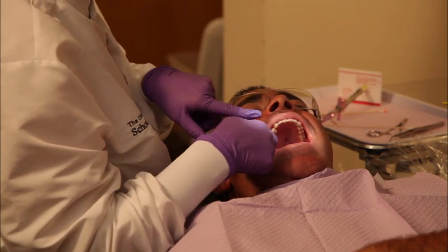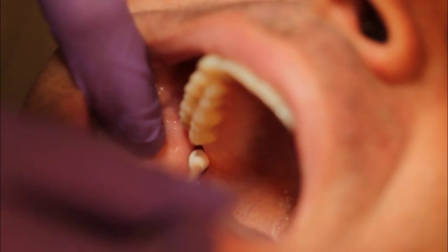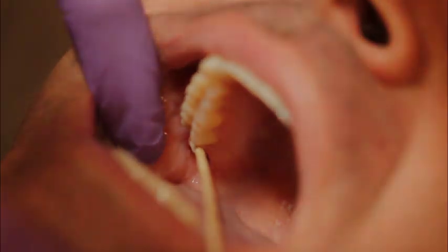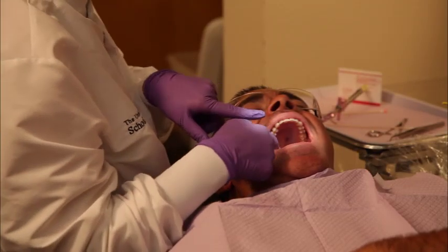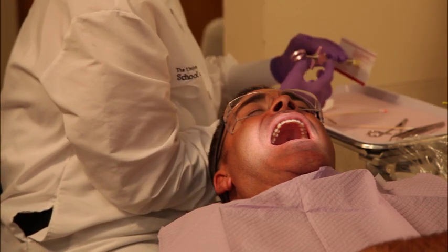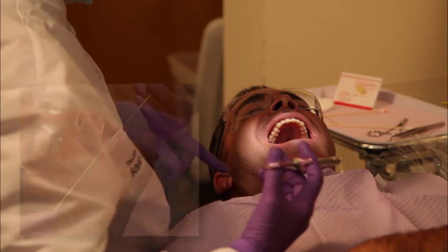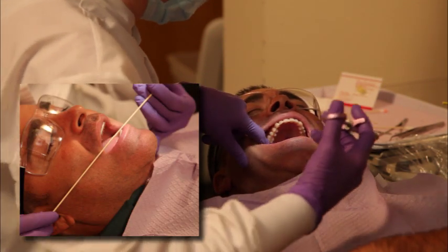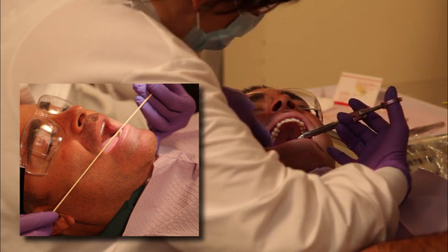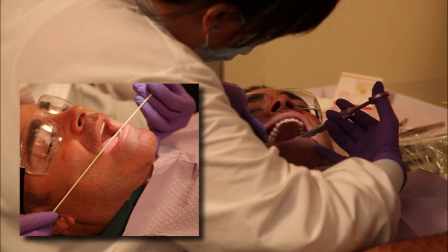Dry the penetration site and prepare the alveolar mucosal tissue with topical anesthetic at the injection site for 2 minutes. Dry the tissue to remove any excess topical anesthetic. Using a 25-gauge long needle with the large window towards yourself, direct the syringe over the contralateral mandibular canine to premolar region so that the angulation of the syringe parallels an imaginary line connecting the ipsilateral corner of the mouth and the lower border of the tragus, the intertragic notch.